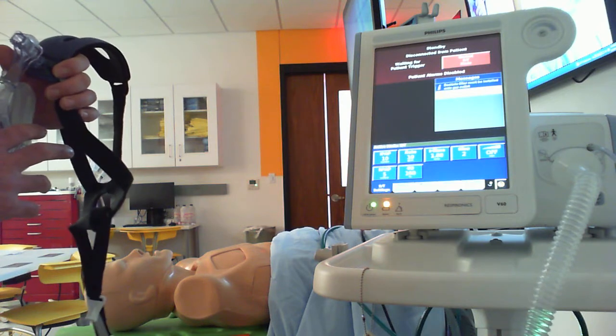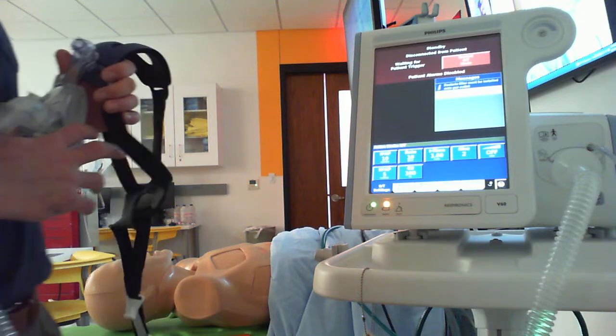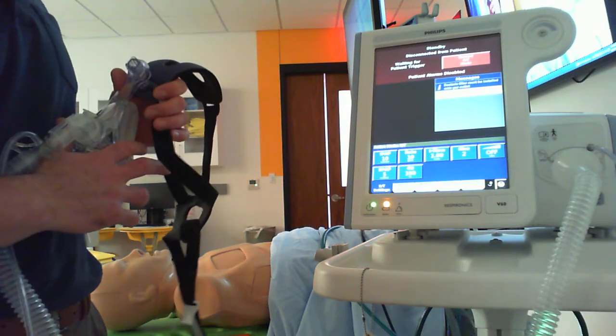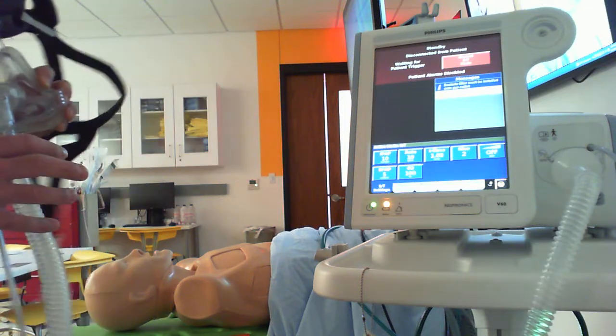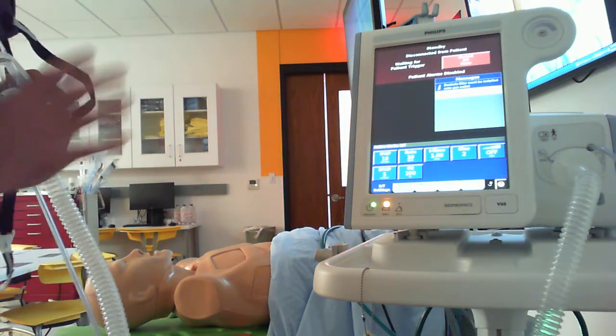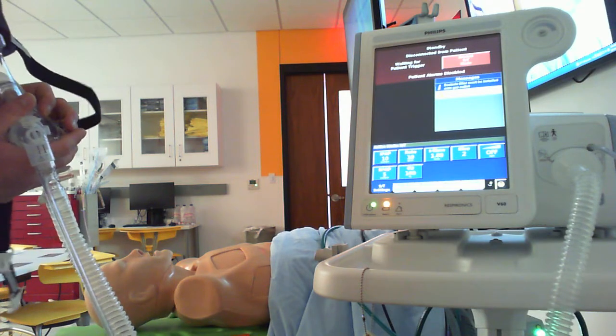So what I'm going to do, I'm going to kind of hold this mask up to your face, let you get kind of used to it. All you got to do is really start the breath and let the machine do most of the work, okay? So start that breath and let that thing kind of push some air into your lungs. I am going to make your settings much more comfortable once I get you strapped in. I'm just going to let you get used to this, and I'll kind of get you quickly all tucked in here and get you feeling better, okay?